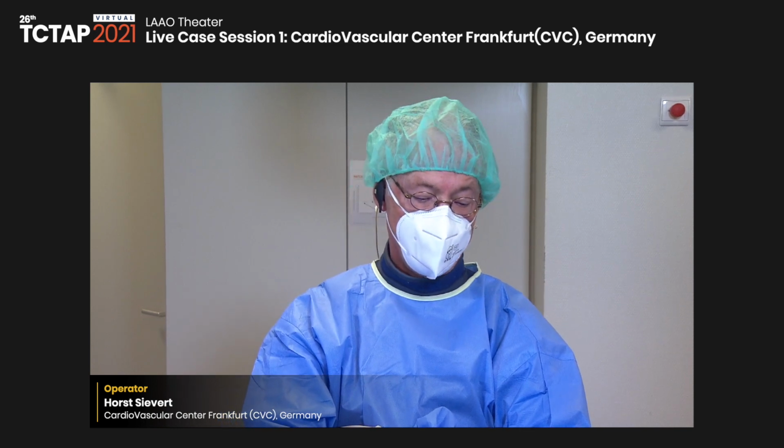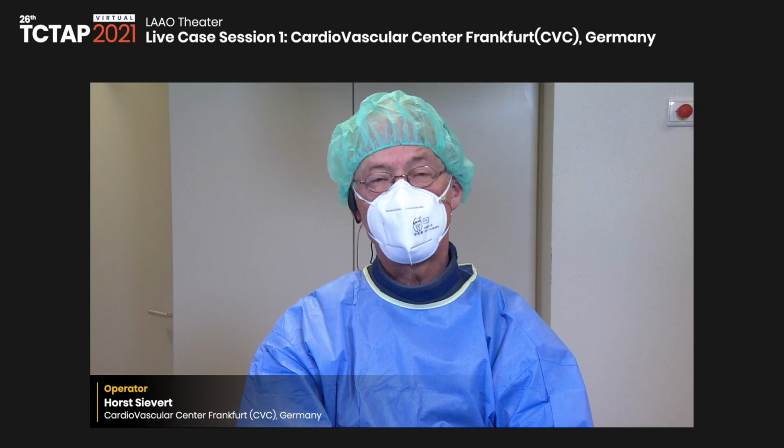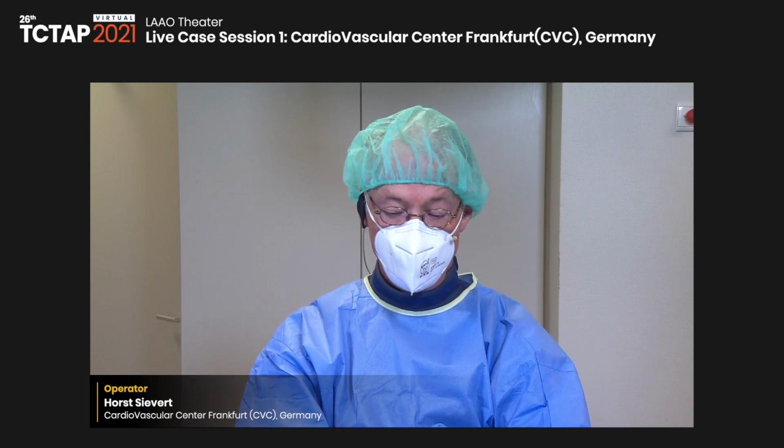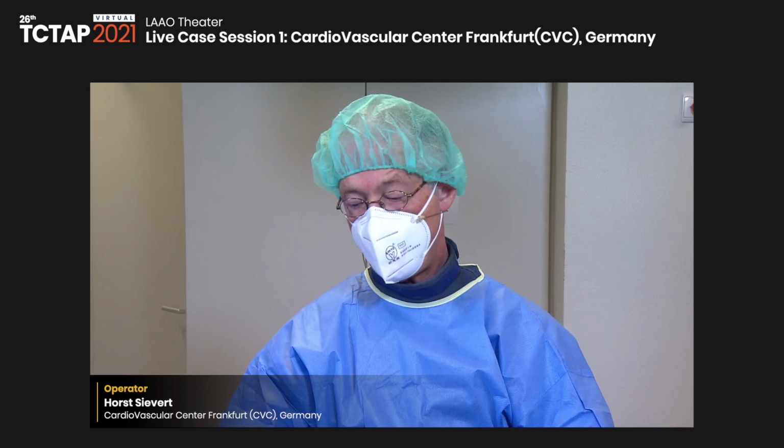The issue with thrombus is that really nobody knows what the best time interval is to do these follow-up images. That's our routine since the beginning. Others do it after 3 months, others do it after 1 year. And we believe, from our experience also with other devices like ASD or PFO closure, that most likely the majority of thrombus occurs within the healing period, which is up to 6 months. So I think it's rare that thrombus develops beyond 6 months, because we assume that at that time all these devices are more or less covered.